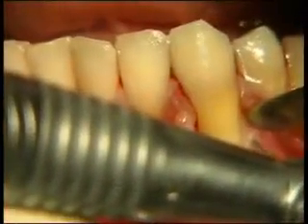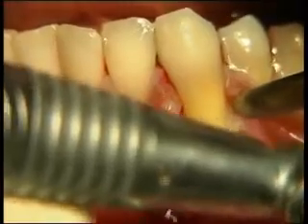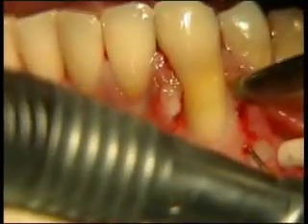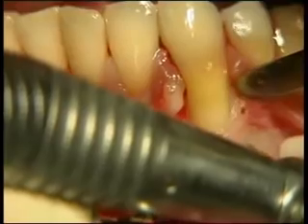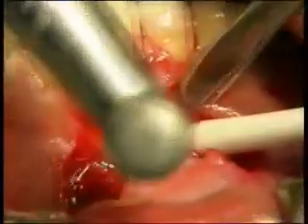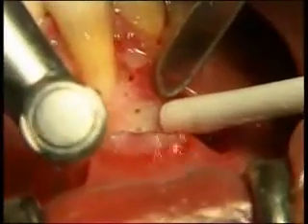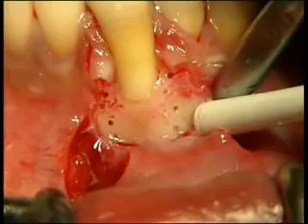At this point, a cylindrical burr is used with a diameter of 0.8 mm — the same diameter as the Ethicon PDS-II suture — mounted on a low-speed handpiece, to create four holes in the interproximal spaces adjacent to the root. The two coronal holes must only be a couple of millimetres more coronal with respect to the point of maximum bone recession, and at the same time a few millimetres apical to the amelocementum junction.